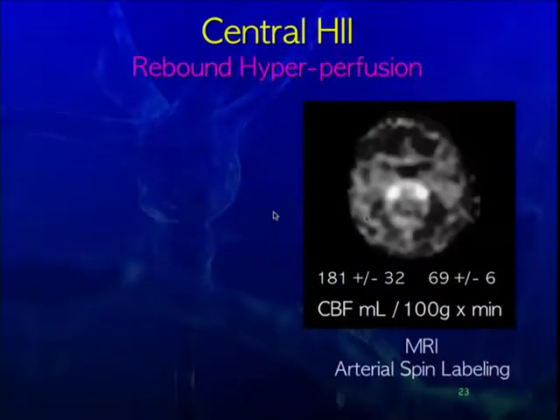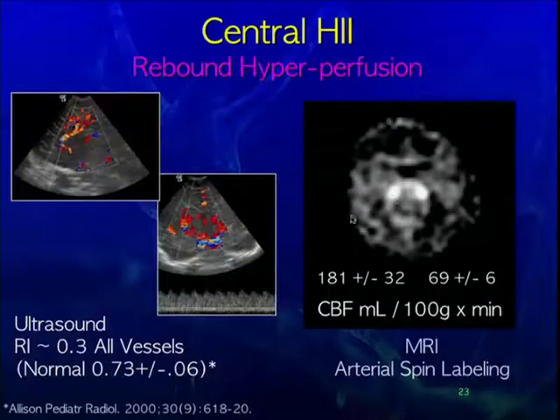What we can say when we run perfusion imaging, for example, and we see this high blood flow, is that the environment is ripe for delayed cell death, because you need energy to go through delayed cell death mechanisms. So if we see these hyperperfusion states, we know they're at risk for continuing evolution.